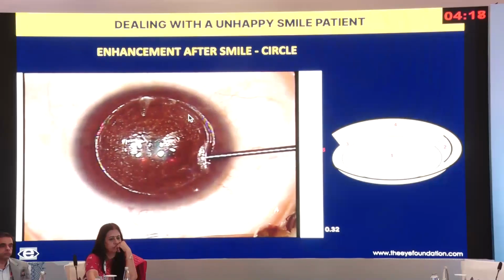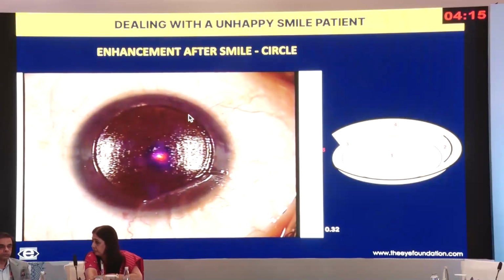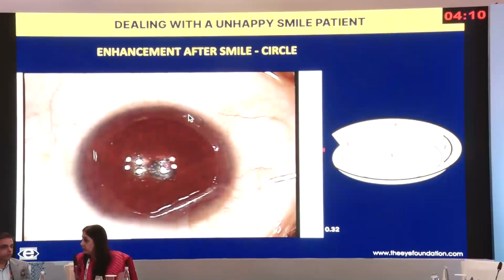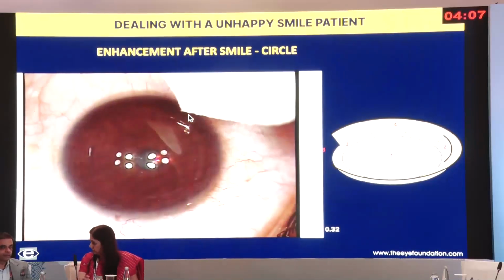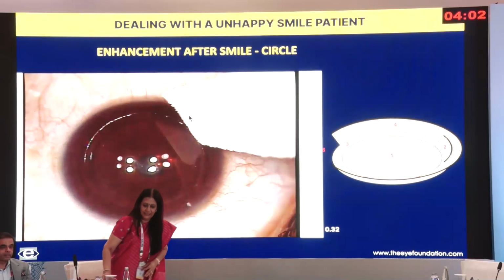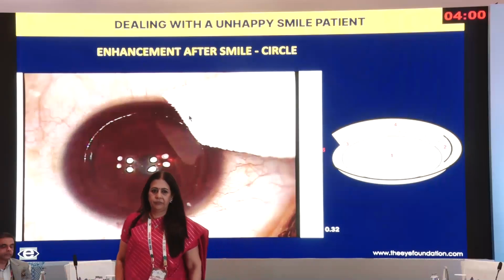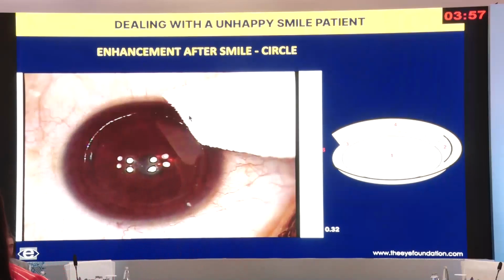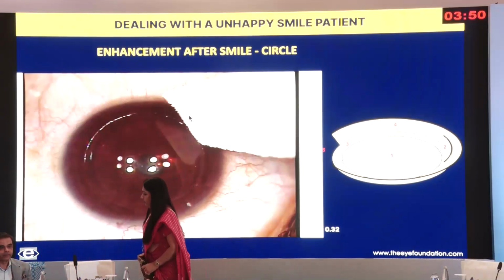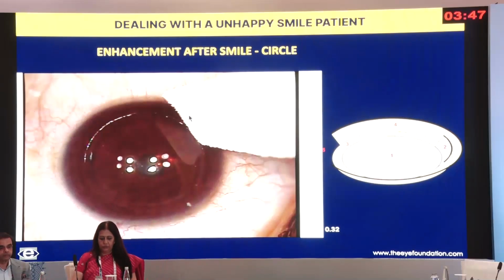The thickness of the flap is the same as the cap, and whatever error is there, you can go ahead and treat it. The arguments I have against this very simple procedure, very easy to do, with very satisfying results, is that all along you have been promising the patient a flapless procedure, and now you are making a flap with all the vagaries of the flap. And the other thing is, if you're doing a PRK, it is basically only the stroma in the cap itself that you're using. The underneath stroma thickness is not used.